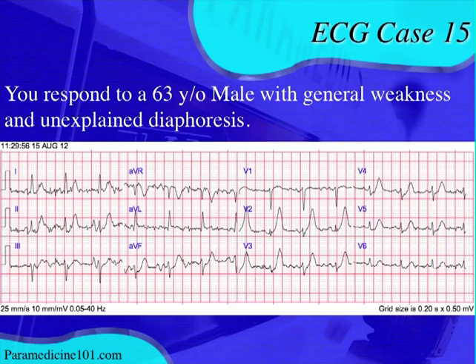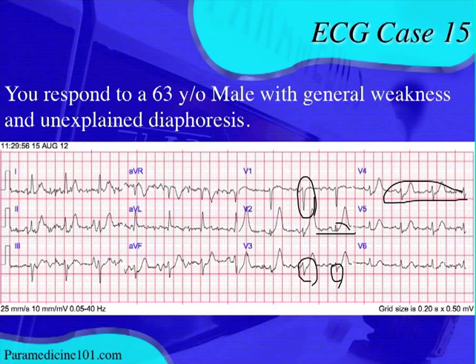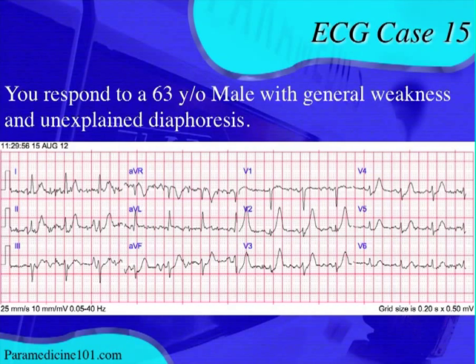Looking at the precordial axis, it's hard to tell due to the artifact. V1 is definitely mostly negative; V2 is hard to read but looks mostly positive; V3 looks mostly negative; V4 is almost isoelectric. With this much artifact it's difficult to know where the baseline is, so we can't reliably determine the precordial axis, and we'll move on.